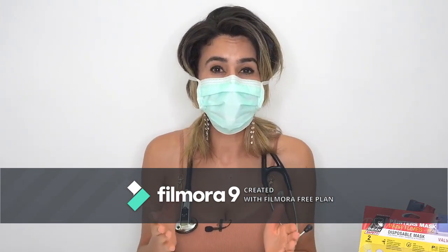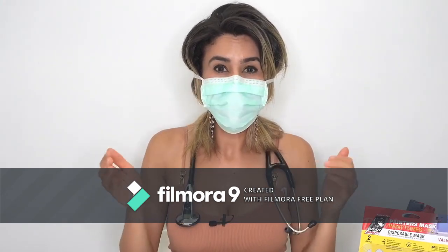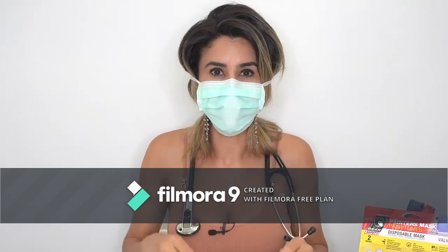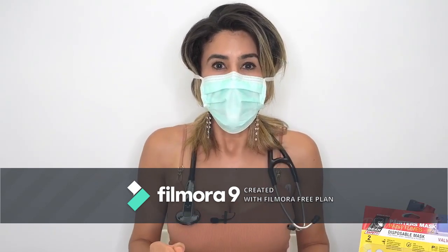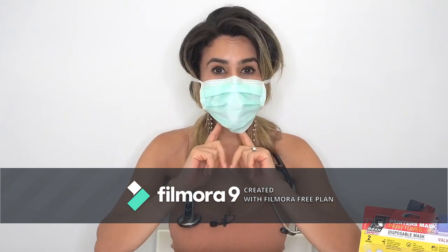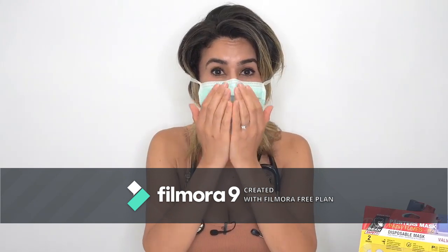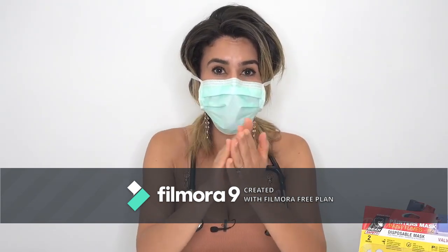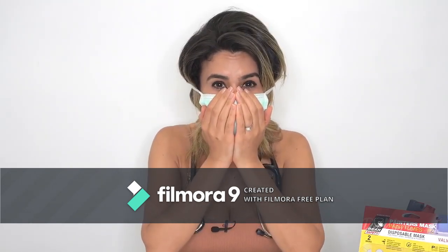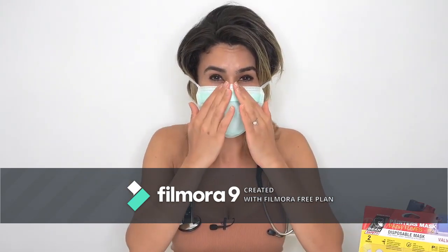Once you're satisfied, perform a fit check by taking a deep inhalation. When you inhale deeply you should see your mask move inwards because of the negative pressure — as you can see, my mask goes inwards meaning there is no seepage from around the mask. Next, perform an exhalation test: place your hands across your mask and blow out as hard as you can, feeling with your fingers for any loss of air. If you feel no loss of air when you exhale, you know you've got a tight fitting mask.